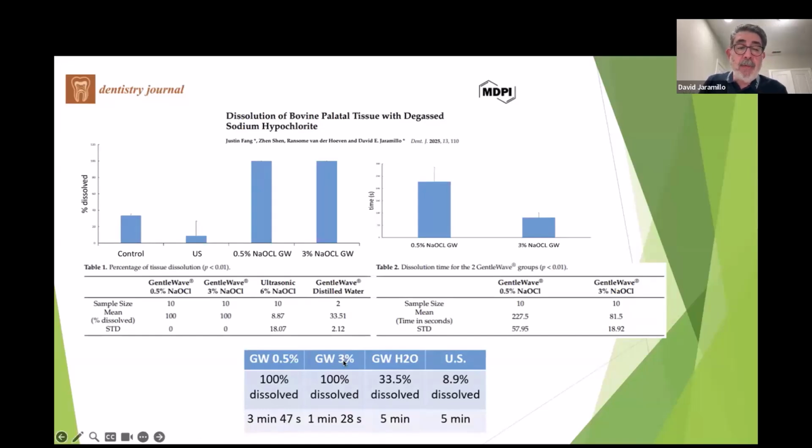When we use GentleWave with 3% sodium hypochlorite, we found 100% dissolution in an average of 1.5 minutes. When we use GentleWave only with water, we found 33% dissolution after a full cycle of 5 minutes of water, while after a full 5 minutes of ultrasonication, we only found 9% dissolution of the tissue.